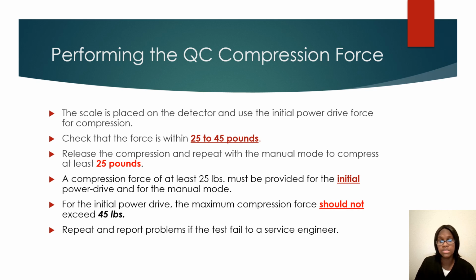A compression force of at least 25 pounds must be provided for the initial power drive and the manual mode. For the initial power drive, the maximum compression force should not exceed 45 pounds. If any problems occur, make sure that you call the service engineer.